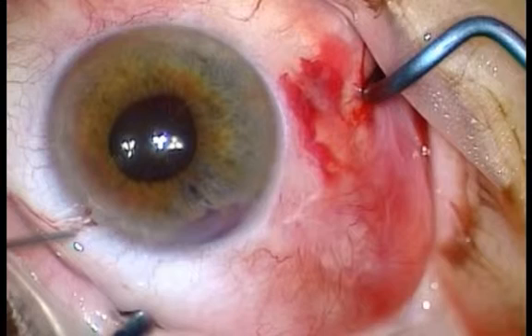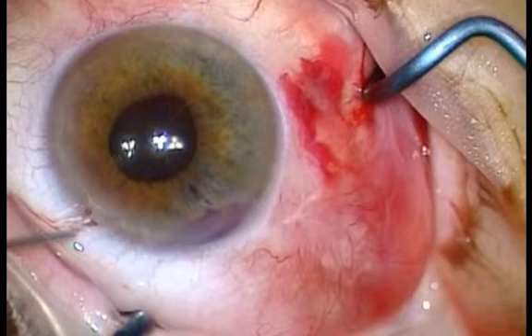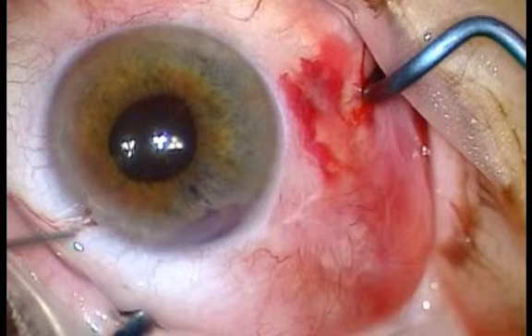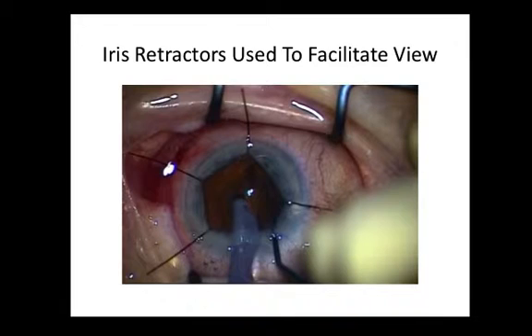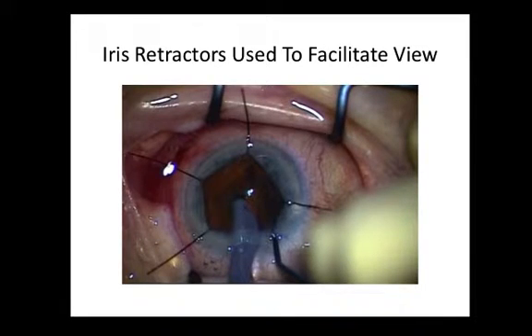This, thankfully, was self-limiting, but it is something which one should always consider when exercising blunt forces upon the iris tissue, whether in a case such as this or when trying to repair iris defects.